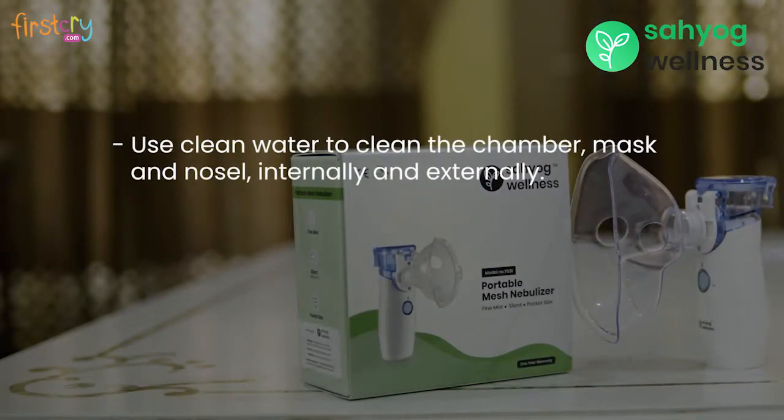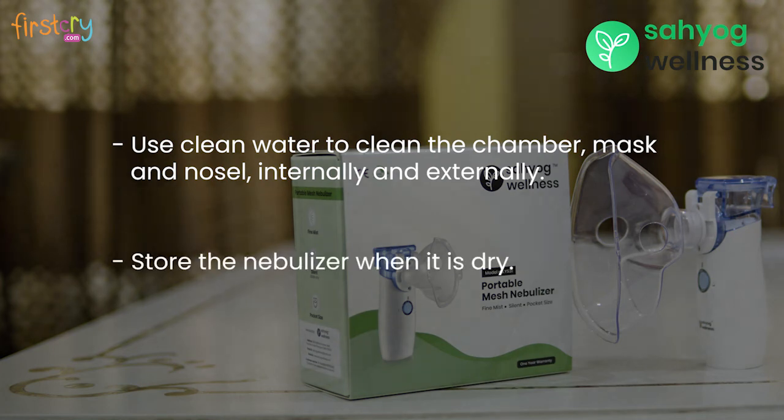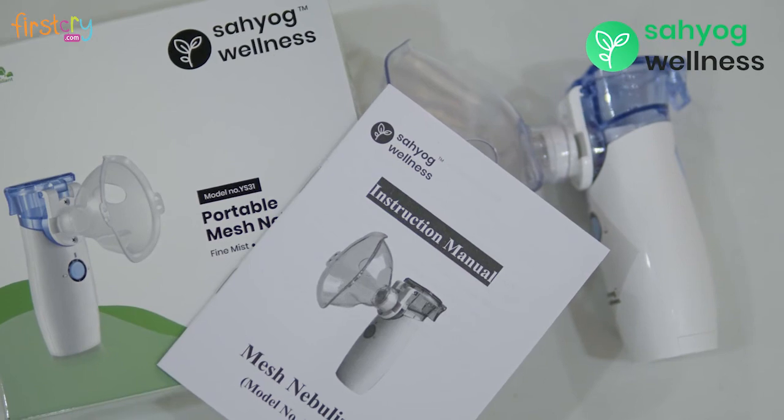Clean the chamber, mask, and nozzle internally and externally using clean water. Store the nebulizer when it is dry. Kindly go through the product manual in case of any query.